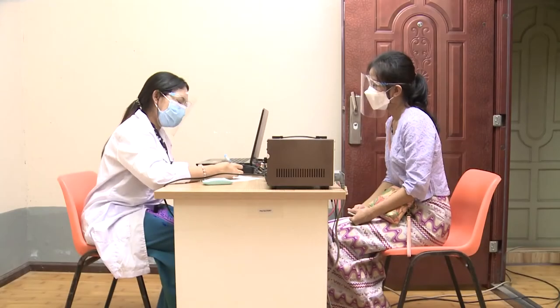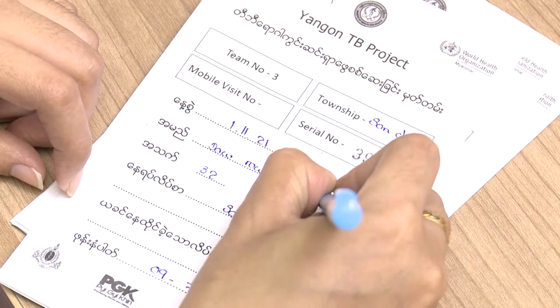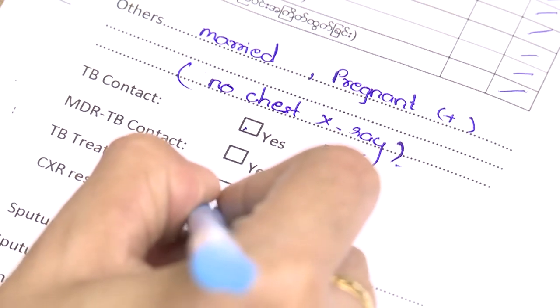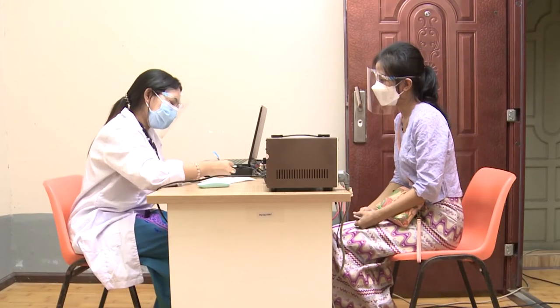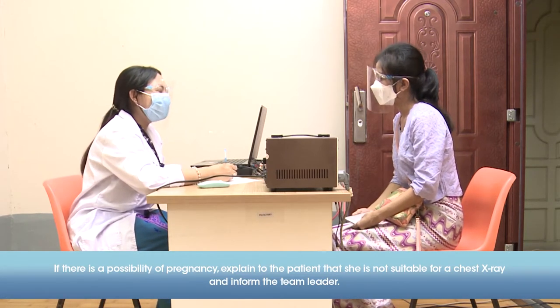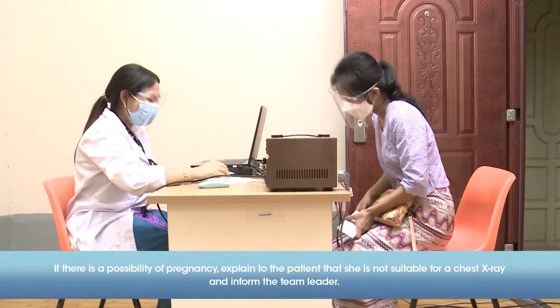Once the patient enters the test room, review the patient request form and ensure the information is correct by counterchecking it with the patient. If the patient is female, ask if she is pregnant or could be pregnant. In case of pregnancy, inform the patient that to avoid exposing the fetus to radiation, she cannot have the x-ray taken, and notify the team leader.